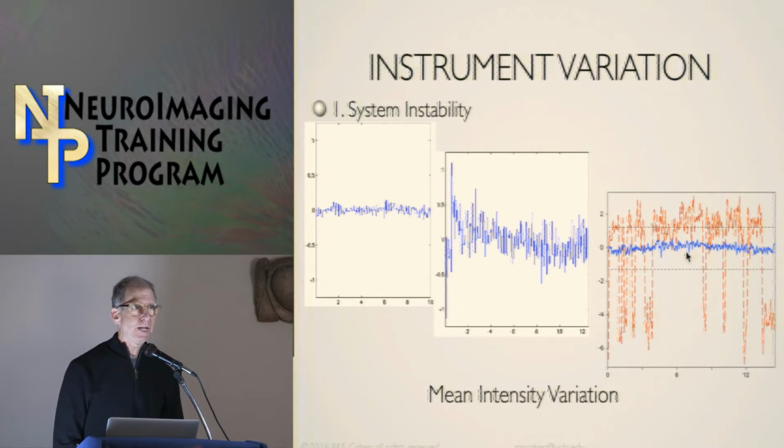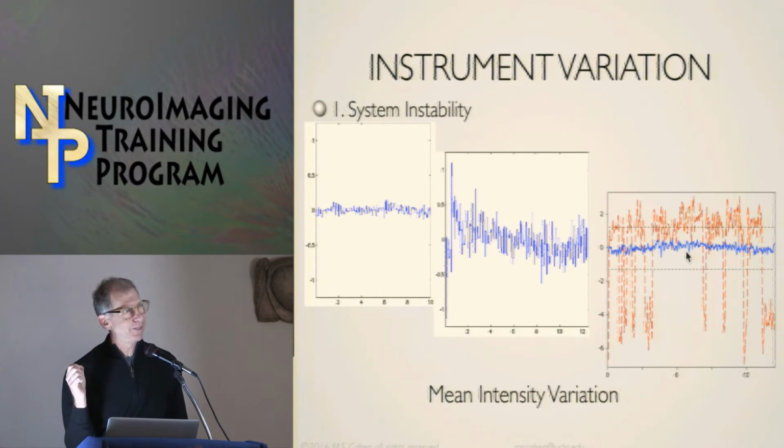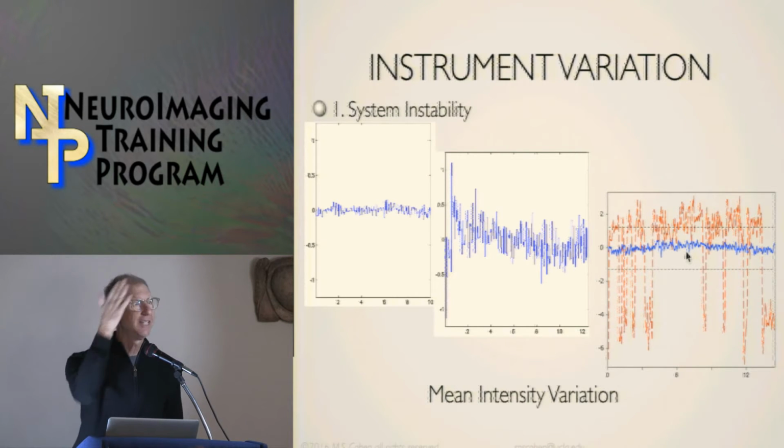So for example, you plug your computer into something on the outside of the scanner room, okay? And computers, as you know, have things switching in them at millions to billions of times a second in the radio frequency ranges that we scan. Power is drawn by your computer, and the fluctuations in the power drawn appear in the power line for the computer, which can leak their way right through a badly connected audio connector or video connector into the scan room and produce these kinds of troubles.